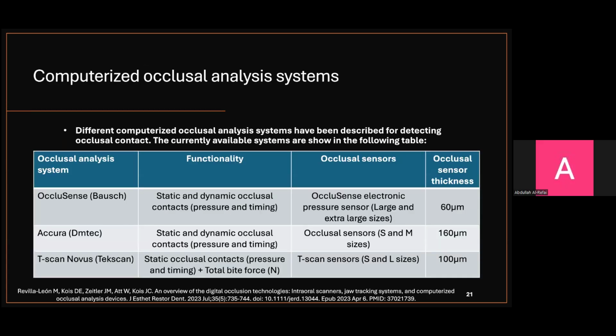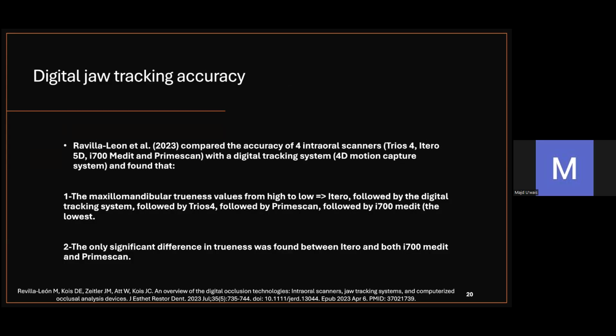Majd, I have a question. In the previous slide, they compared the maxillary mandibular relationship, so what did they compare between these intraoral scanners, the accuracy of what? Trueness to a conventional control. Yes, regarding the maxillary mandibular articulation relation accuracy, the articulation, not occlusion, accuracy. Okay, okay.